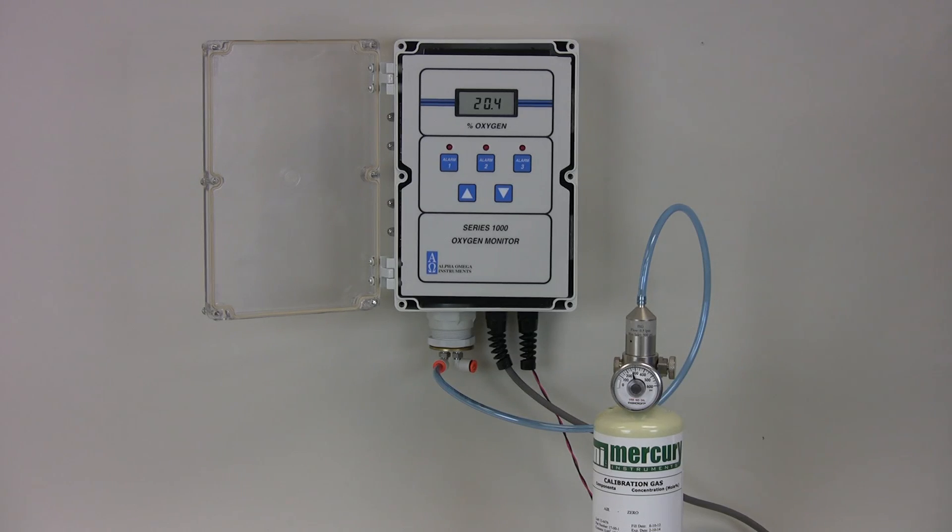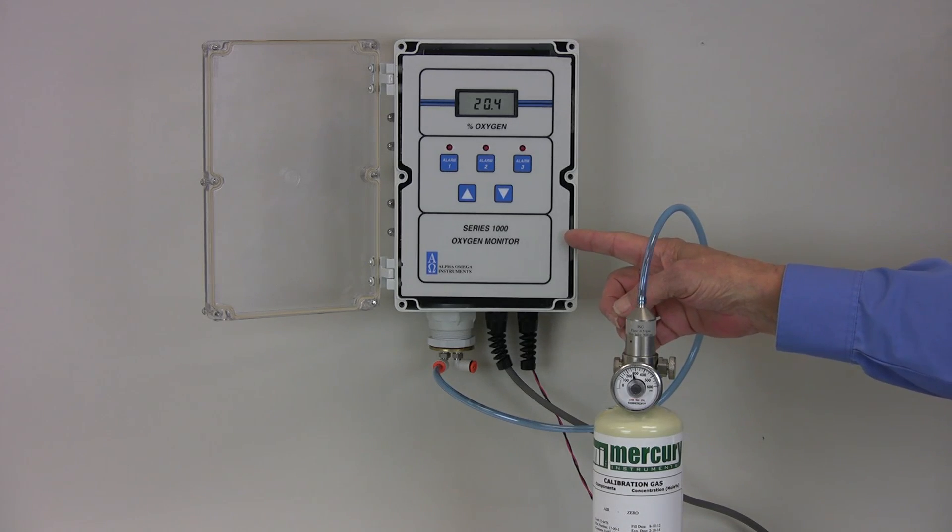Greetings. Today we are going to calibrate an Alpha Omega Instruments Series 1000 Oxygen Deficiency Monitor that has been outfitted with a calibration fixture.